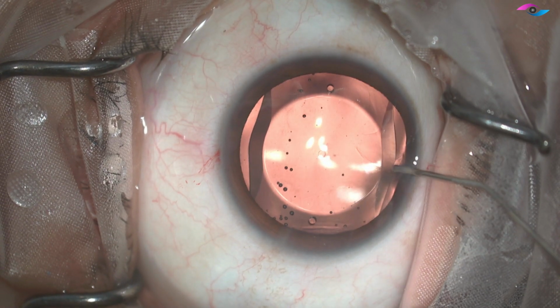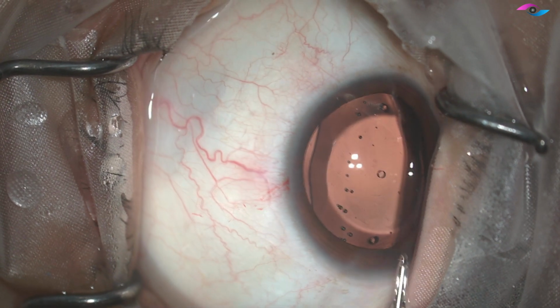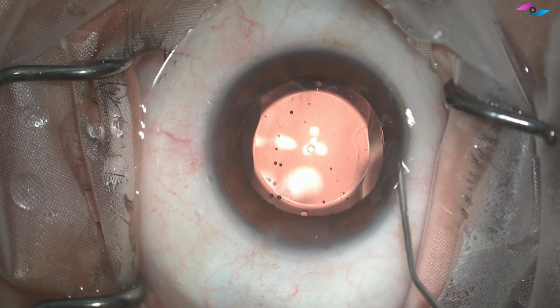And in the end, I like to inject a little bit of pilocarpine just to make sure that the haptics remain in place. And that's the end of the surgery.